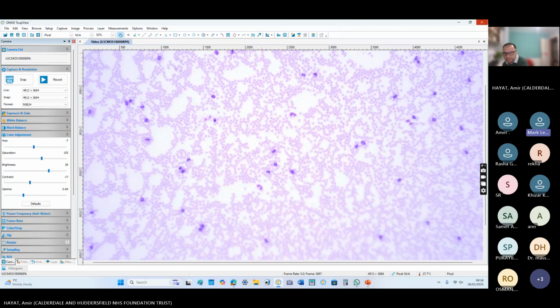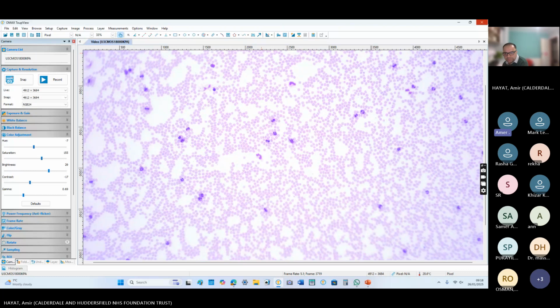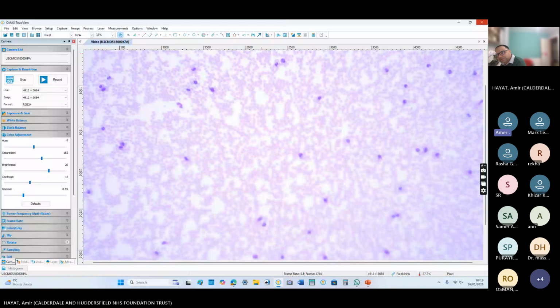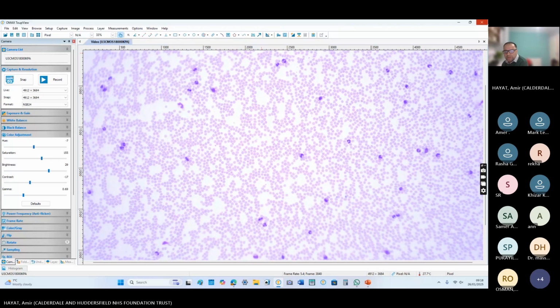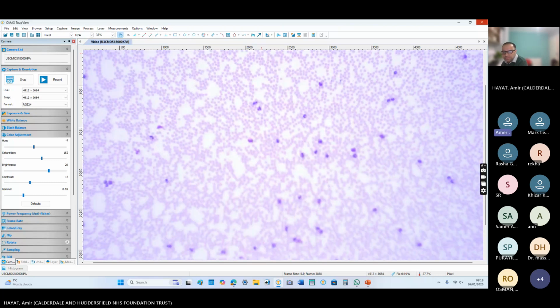Neutrophilia. Okay, so why he has got neutrophilia? Most likely, what are the differential diagnoses of neutrophilia? GCSF. Others? They are mostly left shifted, so I think it could probably be due to the GCSF that he had for the stem cells collection. Yeah. Otherwise, it could be infection or steroids. What else is the differential diagnosis of neutrophilia?